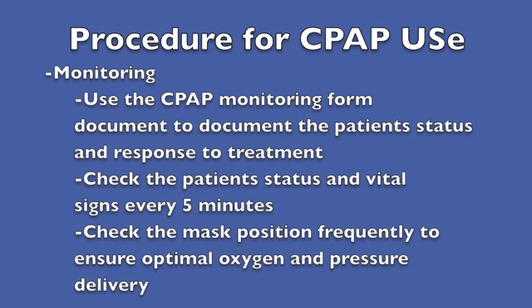Procedure for CPAP use and monitoring. Use the CPAP monitoring form to document the patient's status in response to treatment. Check the patient's status and vital signs every 5 minutes. Check the patient's mask position frequently to ensure that optimal oxygen and pressure are delivered.